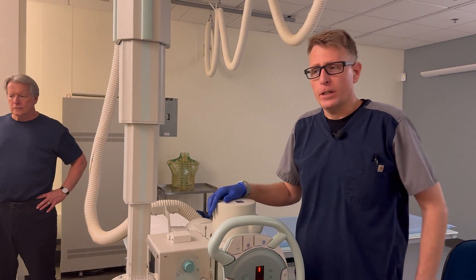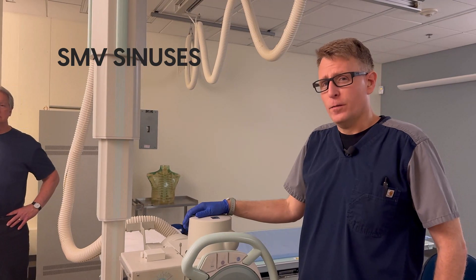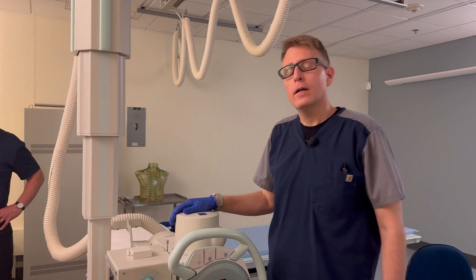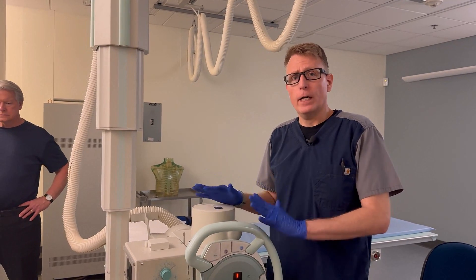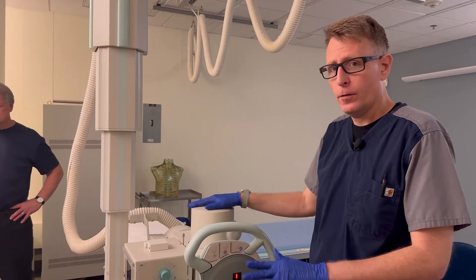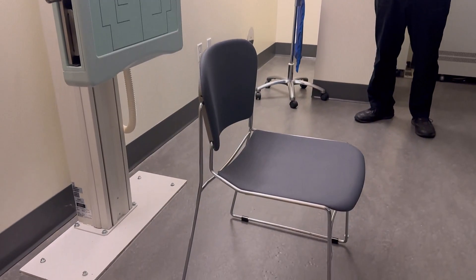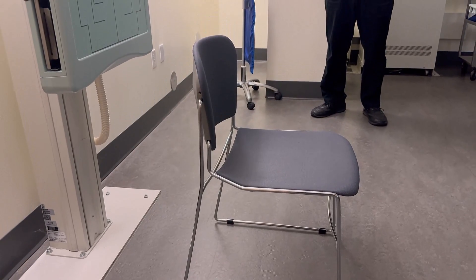Our final sinus projection is the SMV, Submento Vertex. This can be a little difficult for your patient because they have to have their neck all the way back and the top of their head against the bucky. I want stability before I have my patient do that. I recommend a chair with wheels for the other sinus projections, but for SMV, I want a chair that's not going to roll out from underneath my patient. I don't want my patient to fall on the floor.